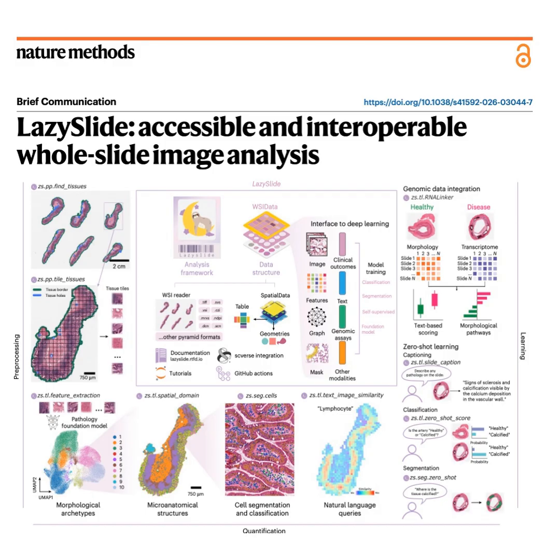And then from there, the pipeline applies something called Otsu's method, right? Let me see if I can explain this. Go for it. So rather than a human just arbitrarily guessing where the cutoff is between tissue and background, Otsu's method looks at a histogram of all the pixel intensities. Right. And it essentially finds the mathematical valley between the two peaks. It calculates the exact threshold that minimizes the variance within the tissue class and the background class, giving you a perfect binary mask. That is exactly right. It's fully automated. Or if the tissue is highly complex, LazySlide can actually bypass Otsu's and deploy a pre-trained deep learning model called GrandQC to generate that segmentation mask.